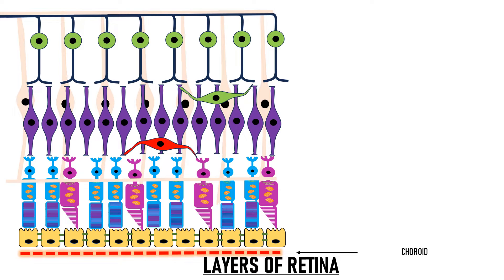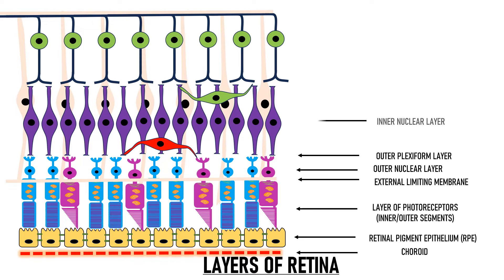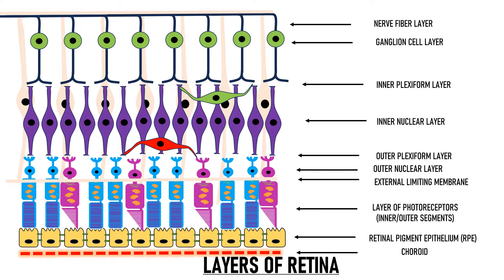This is the choroid, and the layers of retina from outside to inside are: the retinal pigment epithelium, layer of photoreceptors, external limiting membrane, outer nuclear layer, outer plexiform layer, inner nuclear layer, inner plexiform layer, ganglion cell layer, then the nerve fiber layer, and the innermost layer is the internal limiting membrane. Anterior to the internal limiting membrane lies the vitreous cavity, which is filled with vitreous humor.